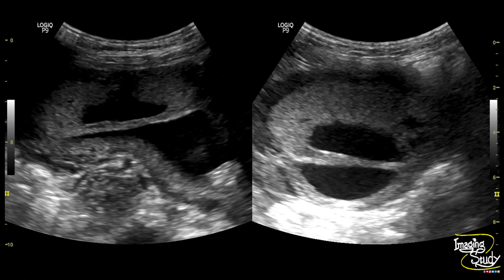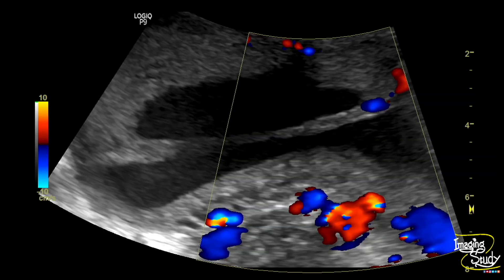Here is the picture of this thick sheet of membrane traversing the amniotic cavity. It has got a wide base here. On Color Doppler, you can see the internal vascularity indicating the presence of maternal tissue.